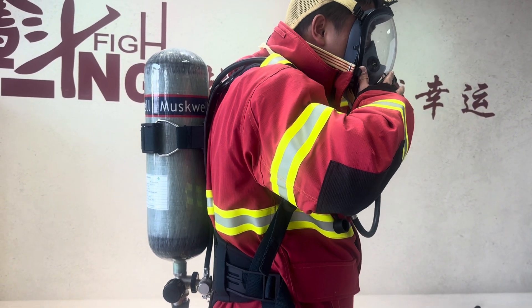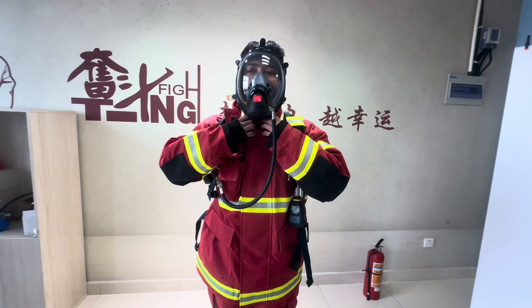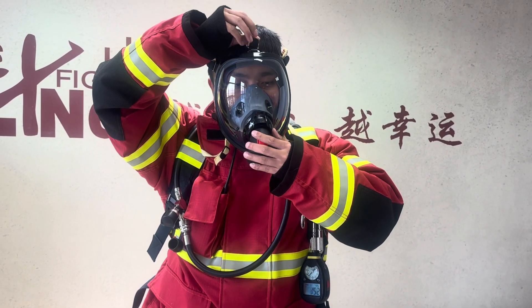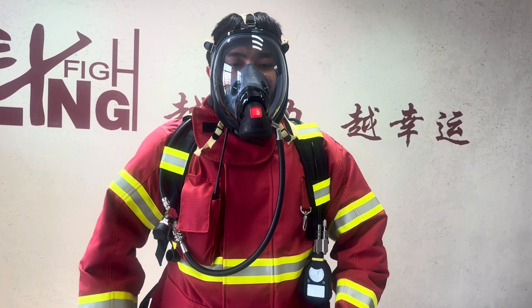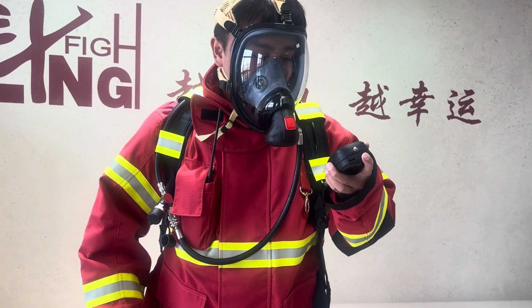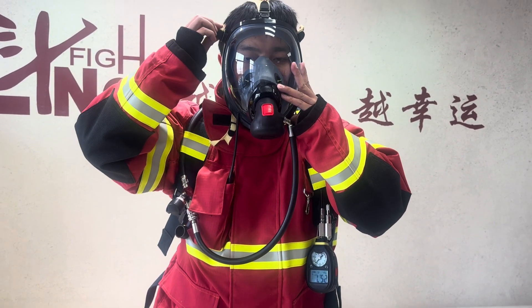Then we need to adjust the face mask straps to make sure you are breathing okay. After that, check the digital alert and adjust the mask again.